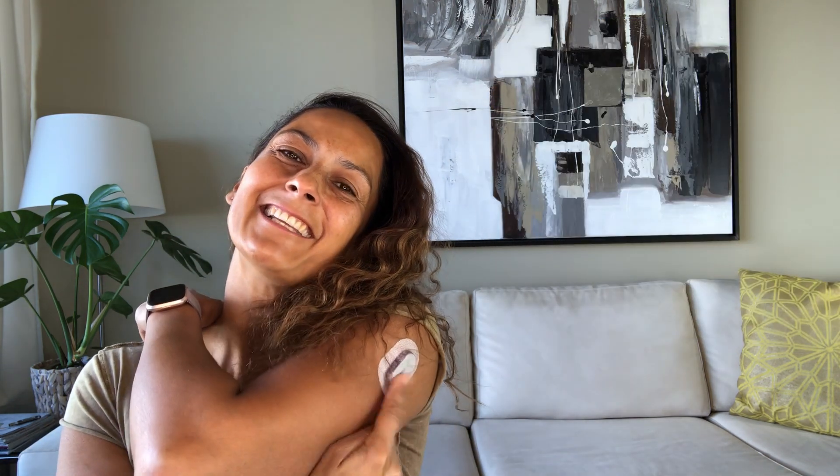This is my favorite placement — my upper arm. This is where I prefer to wear my Dexcom. It doesn't get in the way and I get the absolute best readings there. I place it below the deltoid — the shoulder muscle — so it's a meatier area and I don't feel any pain when I insert it.